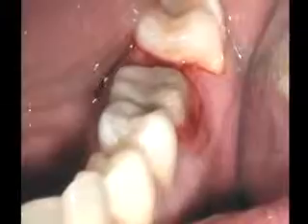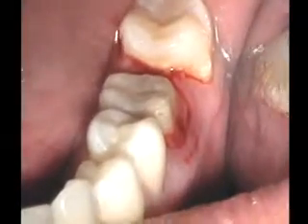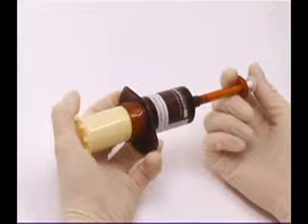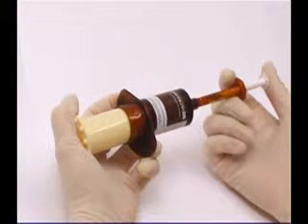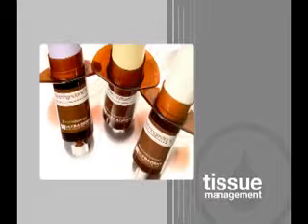To begin, the tooth is prepared in the normal manner, prepping is complete, and as expected, excess blood and sulcular fluid are present. Next, a unit dose quantity of the hemostatic solution is prepared. This is accomplished by using a 1.2 milliliter unit dose syringe, or by attaching a 1.2 milliliter syringe to the Indispense and filling with Viscostat, Astringent, or Astringent X.